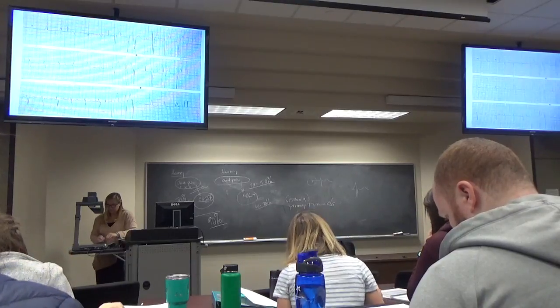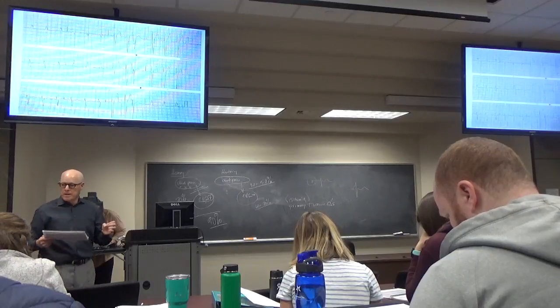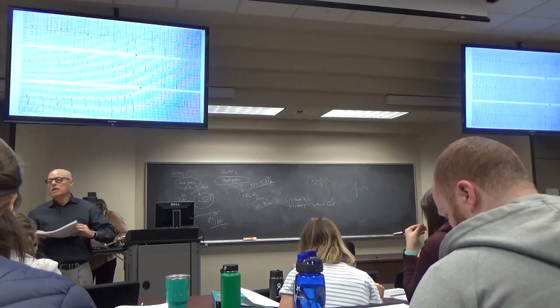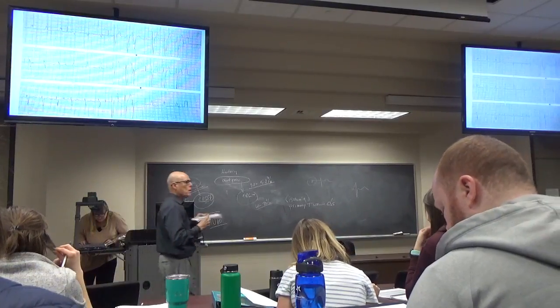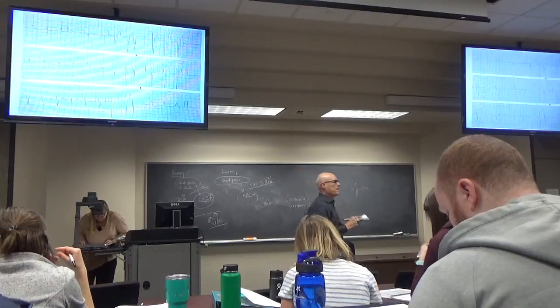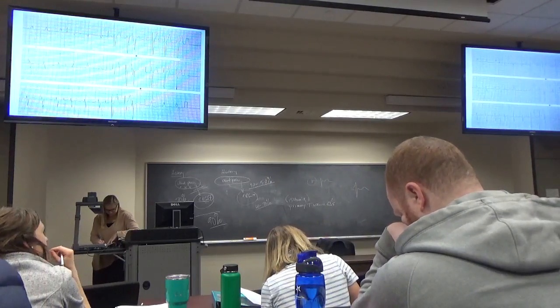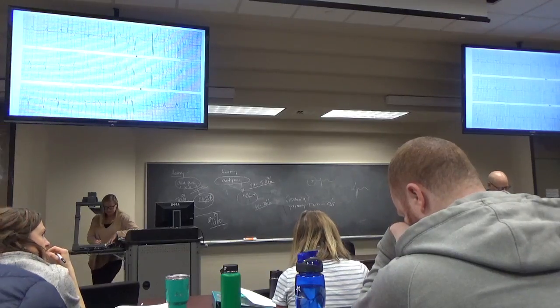Okay, so we've got left bundle branch block. Do we have a first degree AV block? No. There are delta waves in AVL. Are those delta waves in AVL? When do you have delta waves? When the PR is too short. You can't have them when the PR is too long. So this is a first degree AV block. It's a left bundle branch block. I don't think it's long. You don't think it's first degree AV block?